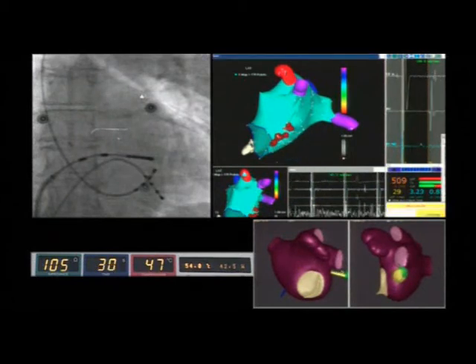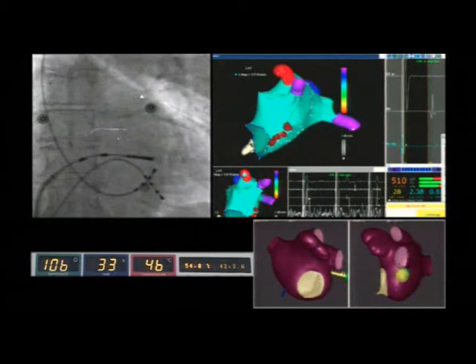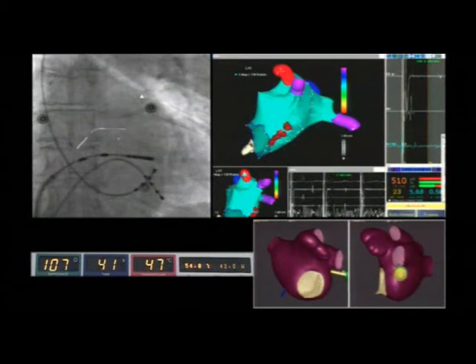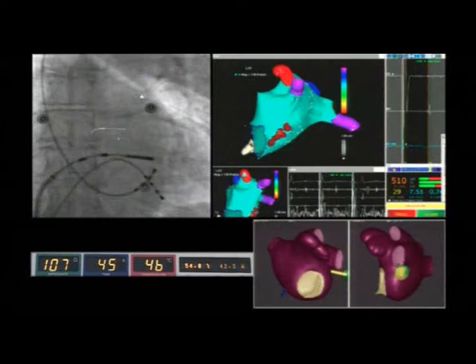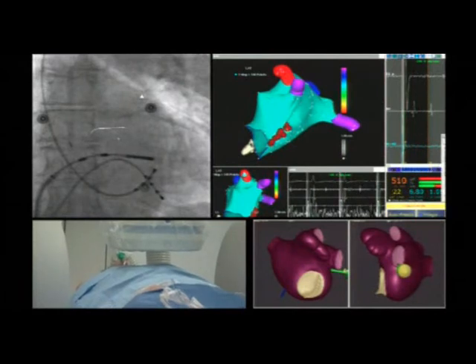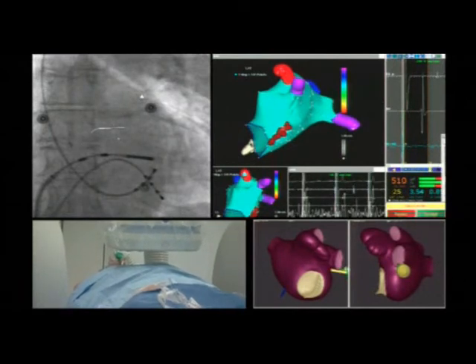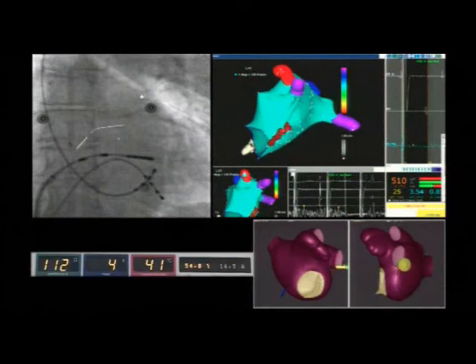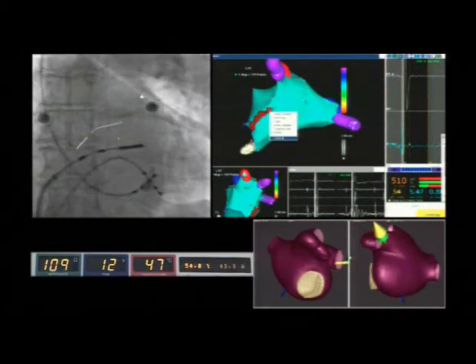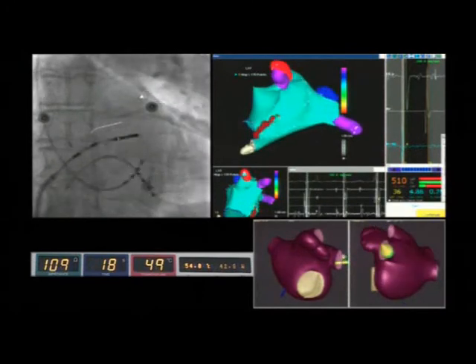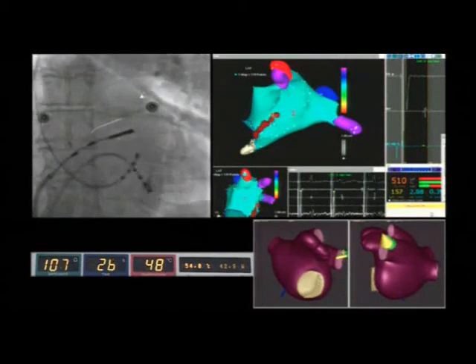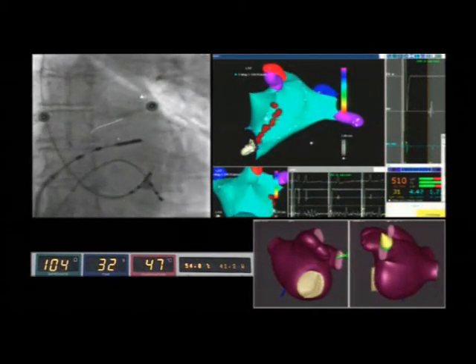The CARTO screen also shows the surface electrocardiogram and bipolar intracardiac electrograms recorded by the ablation catheter at the proximal and distal sites. This is important so that the operator can check the potential abatement during and after the radiofrequency applications. On the right of the intracardiac recordings, there is a window showing the continuous monitoring of impedance, temperature, and radiofrequency power.